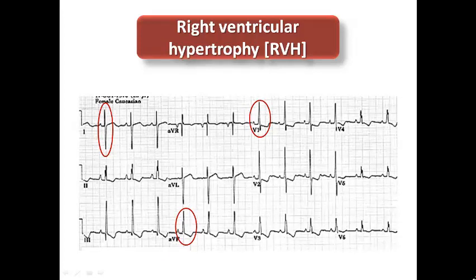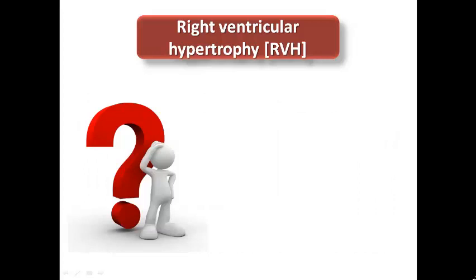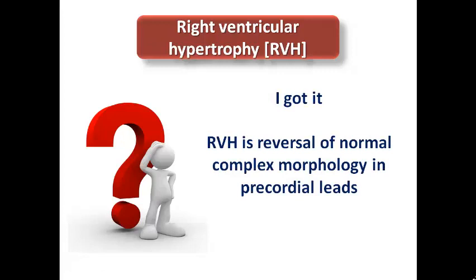In this patient's ECG, we can see right axis deviation represented by the predominantly positive QRS complex in lead aVF and predominantly negative complex in lead I, and a tall R-wave in V1 exceeding 7 mm. While LVH is an exaggeration of the normal complex morphology, RVH is simply a reversal of the normal QRS complex morphology in precordial leads.